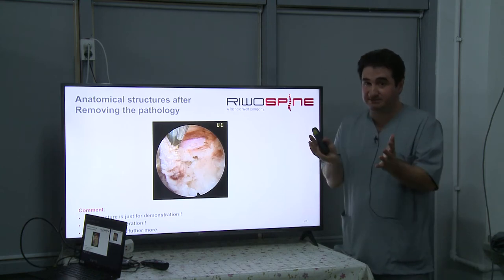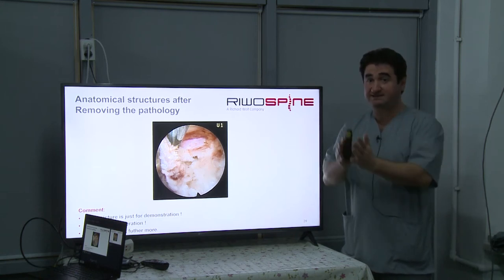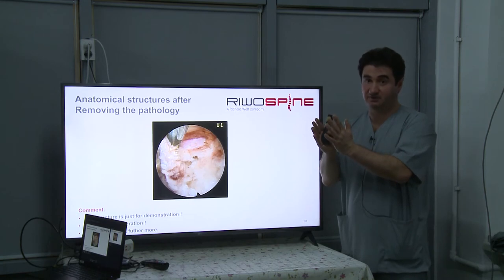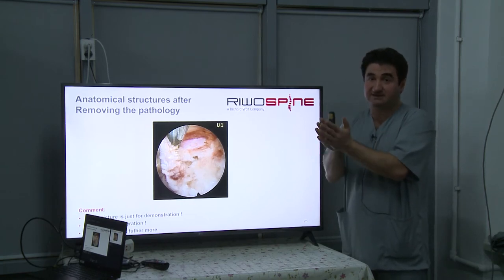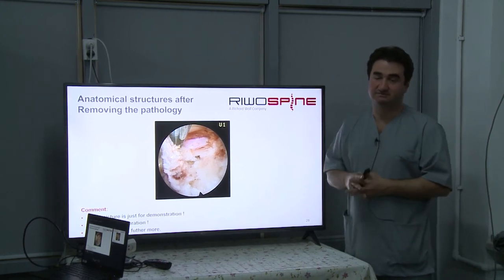It's the basic principle. You have to see the foramen really large, and the space in the caudal side of the foramen. You need a space in the caudal side of the foramen to go. If you don't have space in the caudal side of the foramen, then it's dangerous, of course.